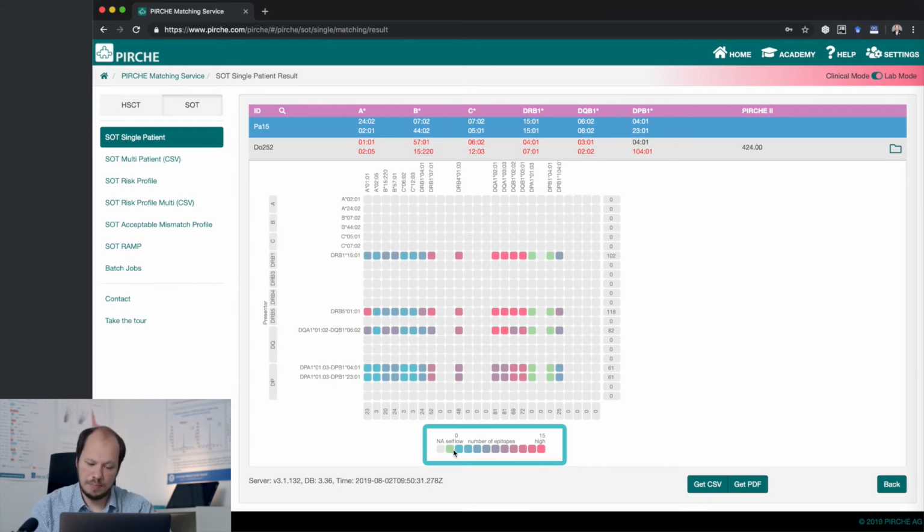therefore you wouldn't expect any presentation to happen here anyway. In blue you now find mismatch situations where not a single peptide is actually being presented, and this goes then on that color range here up to the pink color.